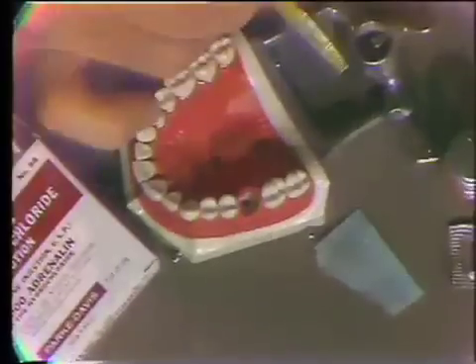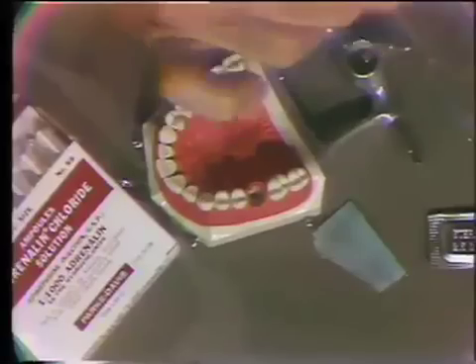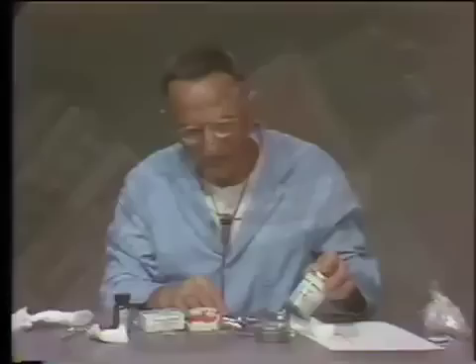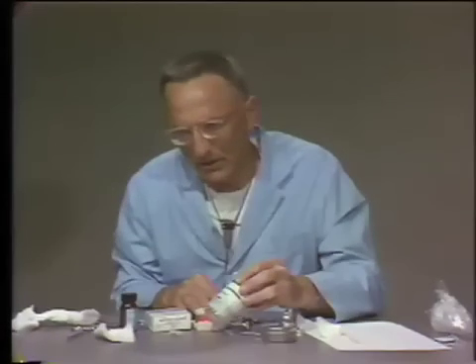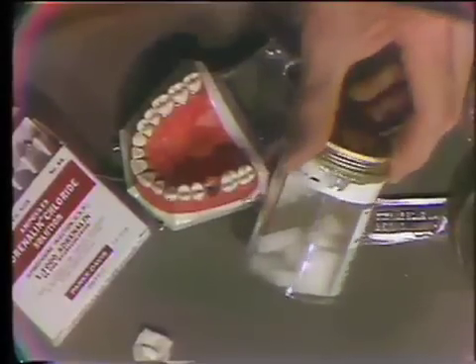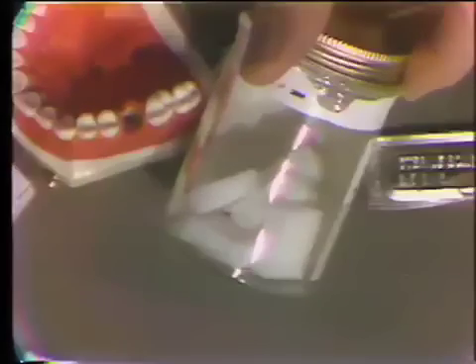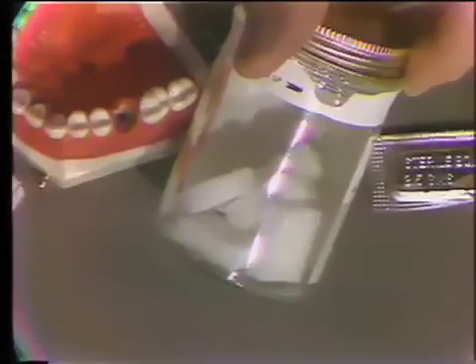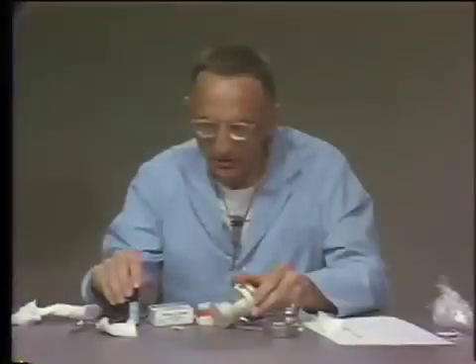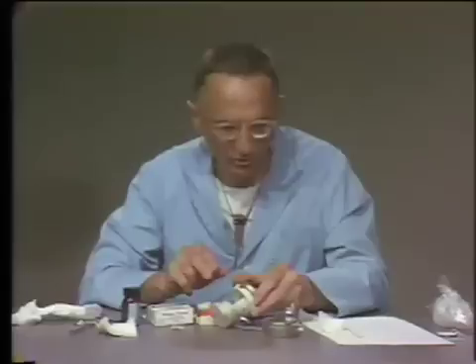Another chemical adjunct to local hemostasis is the use of foam products. Gelatin can be placed in a foam product — this is commercial gel foam. This material can be compressed and used as a vehicle to carry other solutions. Often topical thrombin can be used in this manner, firmly placed down into a socket as another measure to control bleeding.